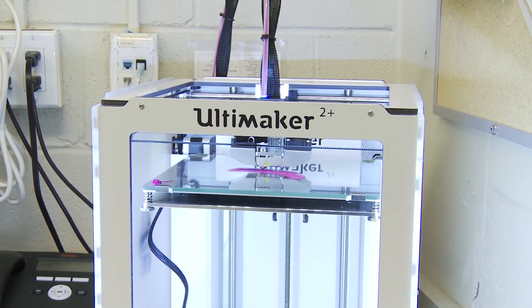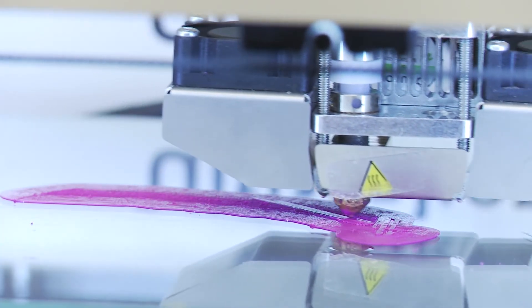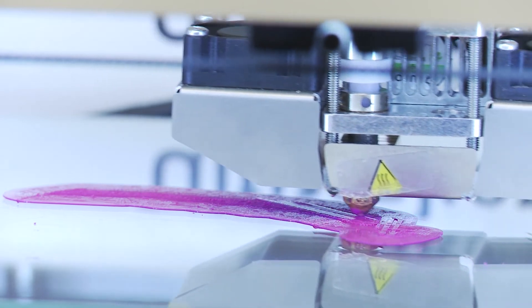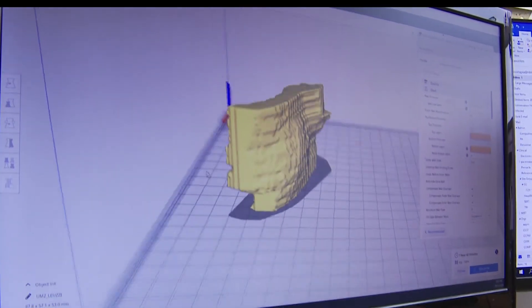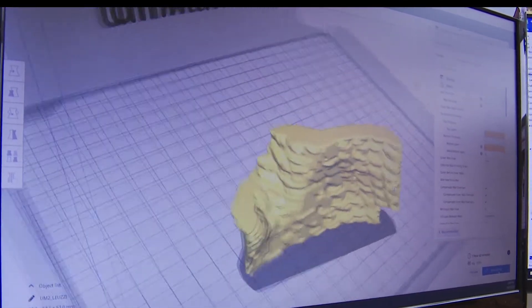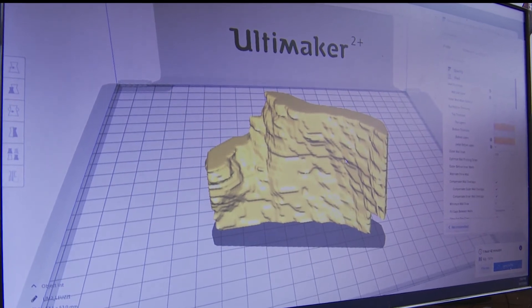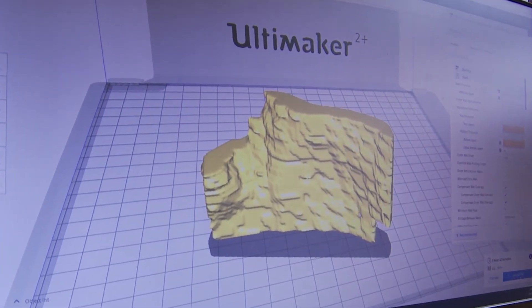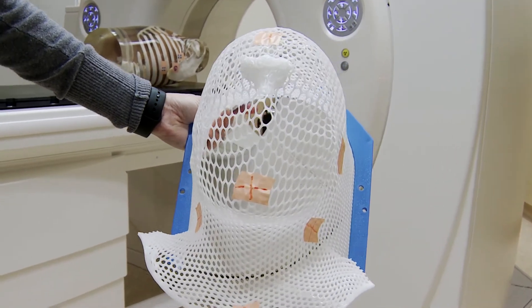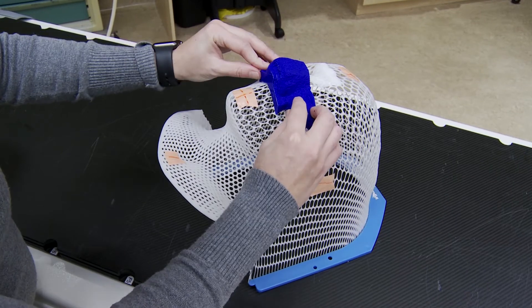Now we've developed a technique that uses 3D printing, whereby we can take that shape and export it directly into a program that will reproduce it in a form that the 3D printer can print. This obviously saves some labor and some time. You can see that the inside surface is somewhat corrugated, and those corrugations actually match the mesh that the patient's wearing, so this actually kind of interlocks into the mesh, making a very good fit.